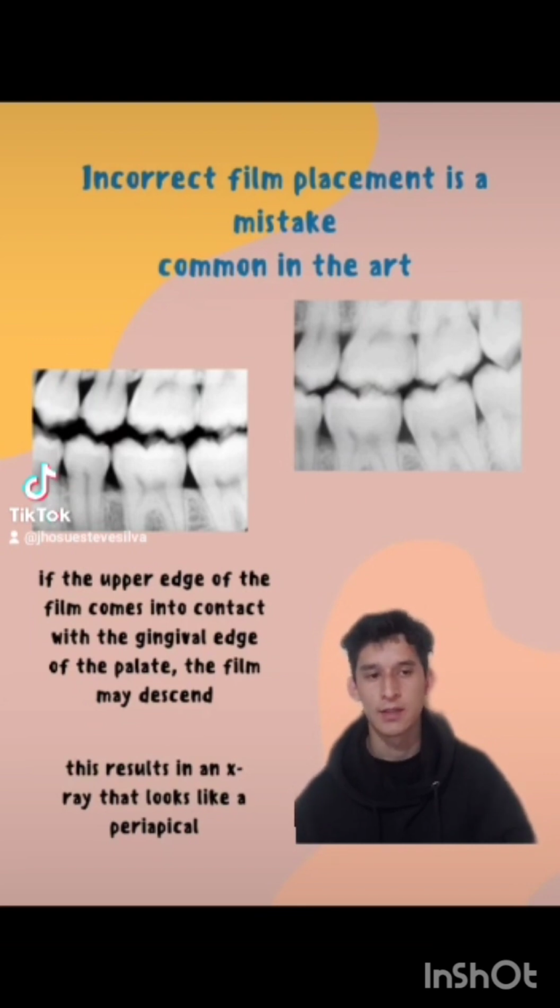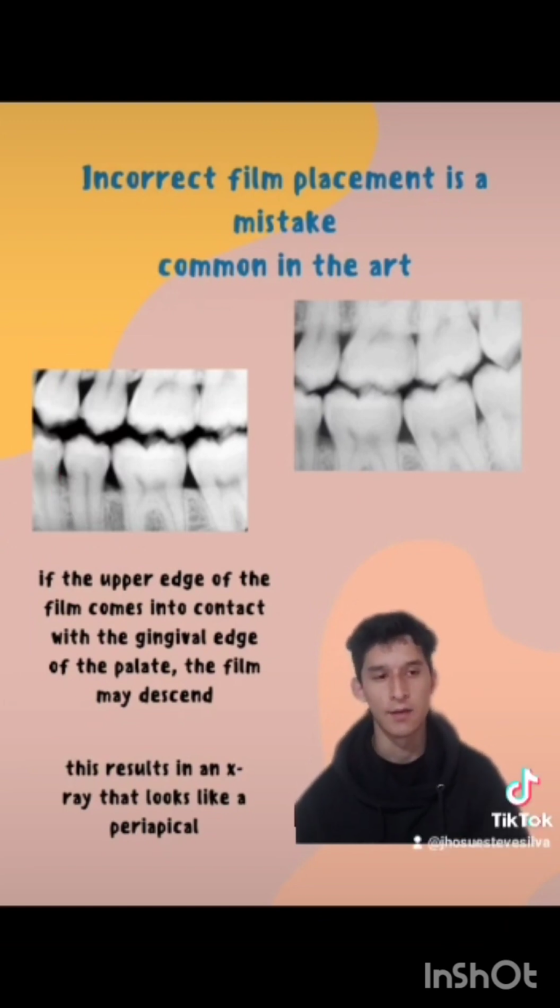However, its disadvantage is that this technique does not serve to identify alterations in soft tissue, and it can underestimate or overlook the depth of the lesions, and it detects only 5% of incipient lesions.